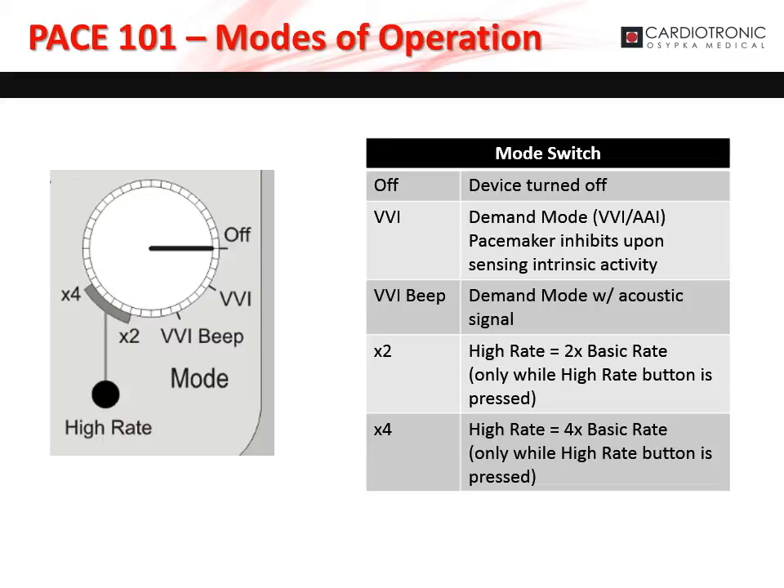The Pace 101 has several modes of operation that can be adjusted using the white dial. Off indicates the device is turned off. VVI indicates the device is in demand mode, inhibiting if intrinsic activity is sensed. VVI beep is the same as VVI mode but with acoustic sounds. Times 2 is high-rate mode — the Pace 101 will pace at 2 times the basic rate when the high-rate button is pressed. Times 4 is high-rate mode — the Pace 101 will pace at 4 times the basic rate when the high-rate button is pressed.